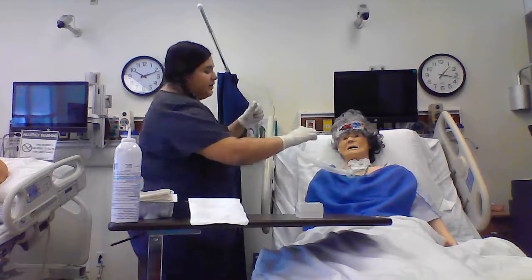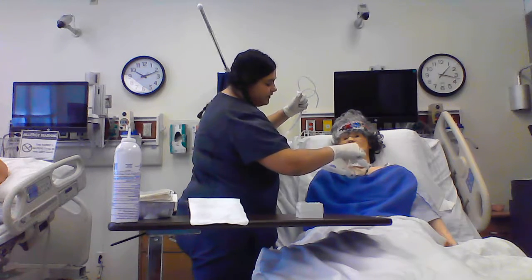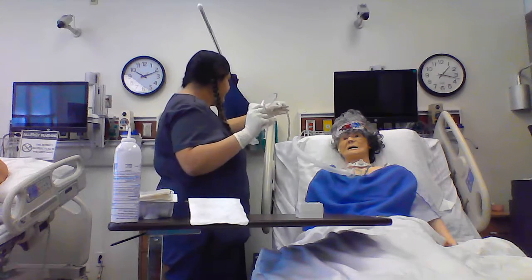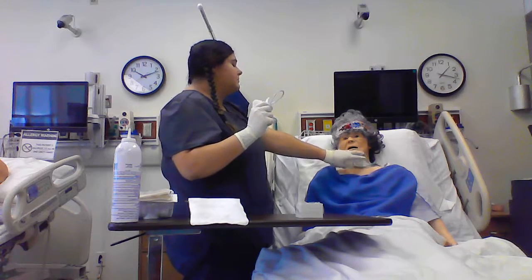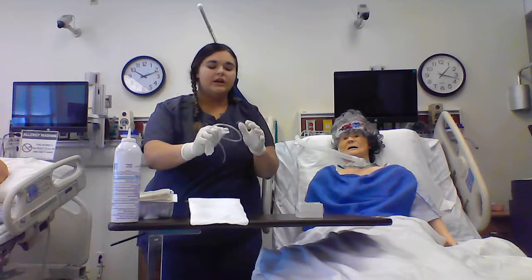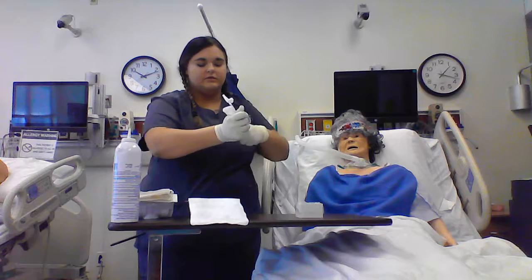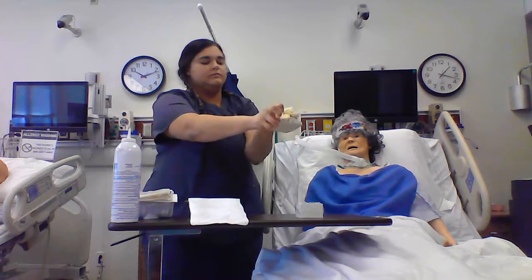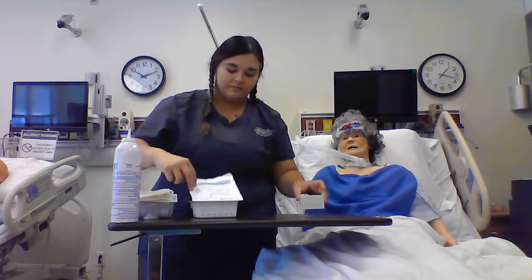So I'm going to grab my V-sponge out from underneath the tracheostomy here, carefully. Going to put it and the inner cannula inside one glove. I'm going to reoxygenate my patient as needed and turn off my suction. And then I'm going to take off my sterile gloves. I'm going to clean up my area here.